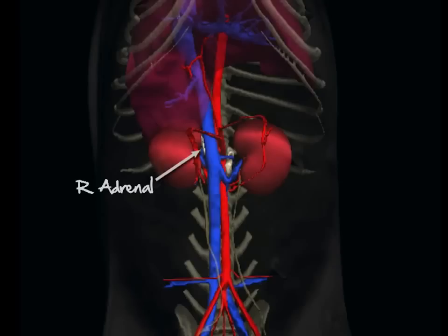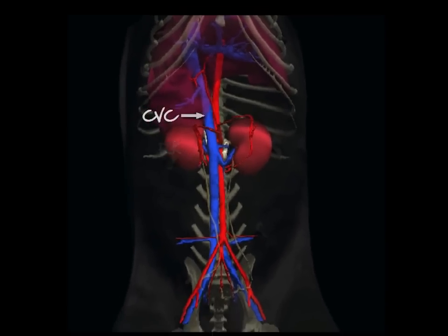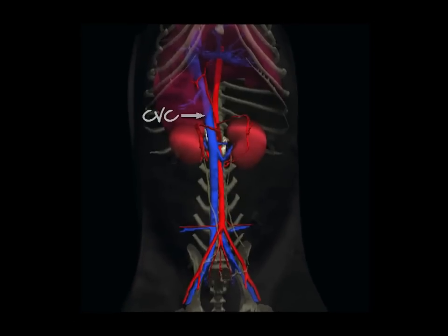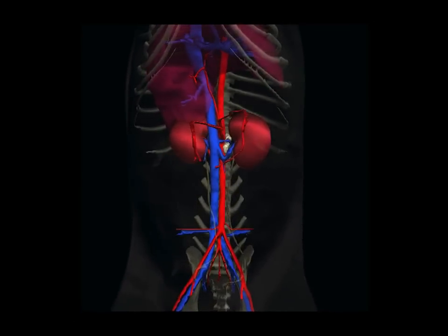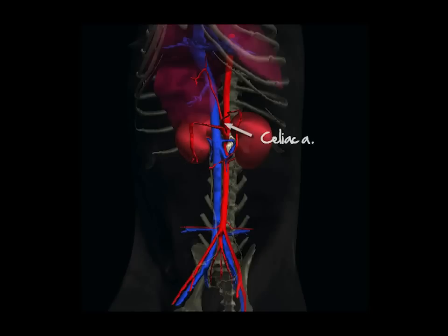The right adrenal is slightly more cranial and dorsal, and medial and dorsal to the right kidney, just lateral and dorsal to the caudal vena cava. The cranial mesenteric and celiac arteries branch off from the aorta just cranial to the left adrenal. The celiac artery, which is closest to the gland, branches into the splenic and hepatic arteries.